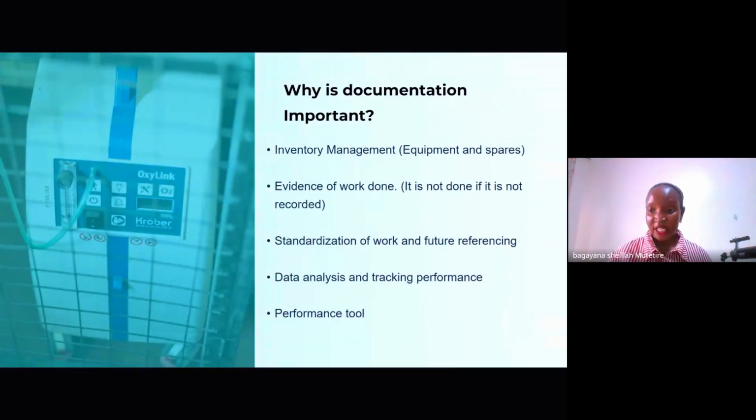So whenever work is done, it's really, really important that whatever you do on an equipment is recorded. So whether the technicians are regional technicians who are working, we need to know what exactly they've done on the equipment. Or even knowing if the concentrator is being used. For example, if the last time you checked the concentrator, it had run hours of, say, 600. You check again, it's now 600 still, then you know this concentrator hasn't been in use.